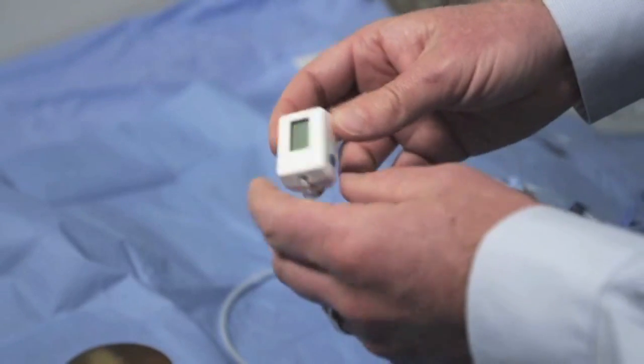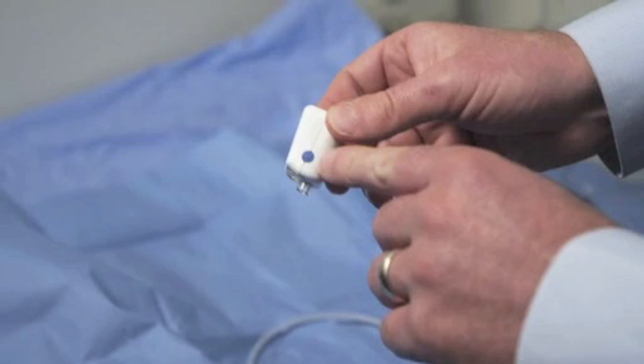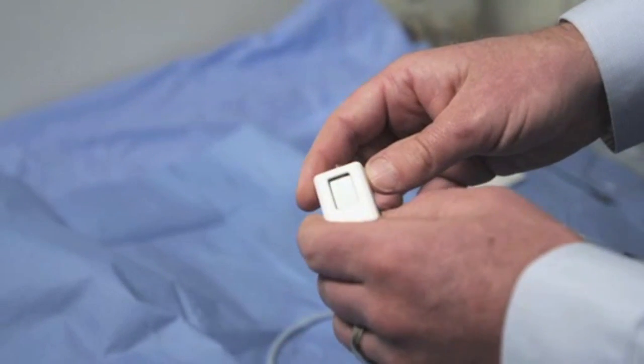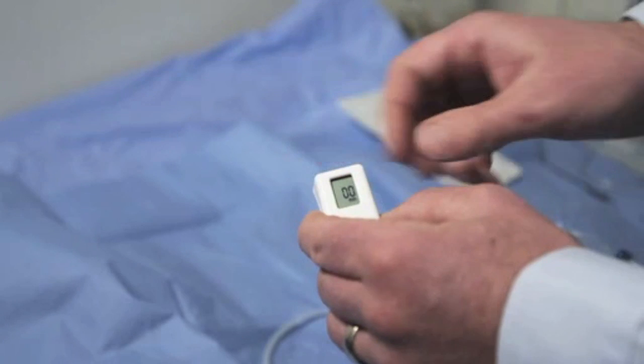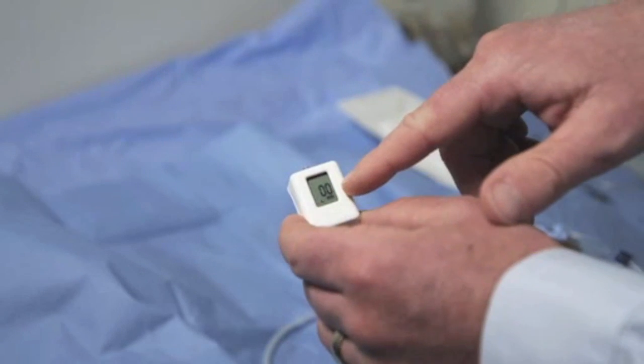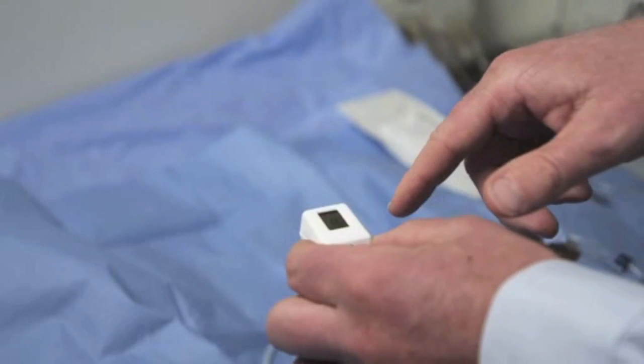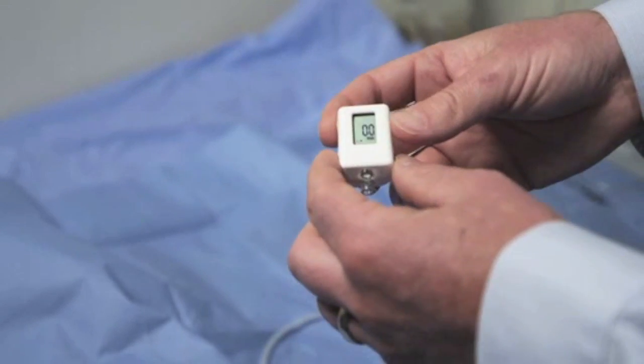The device needs to be turned on and calibrated. This is done by depressing the blue button on the side, and it's important to depress the button until 00 is displayed on the screen, and at this point the device is calibrated to atmospheric pressure.